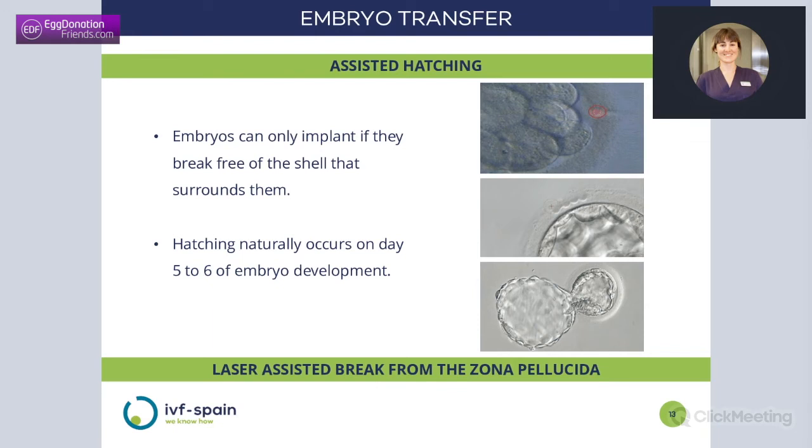There are different ways to do this hatching. There are chemical ways, there are mechanical ways. We particularly like to do it with a little laser beam. It's very easy to control and very safe for the embryos.